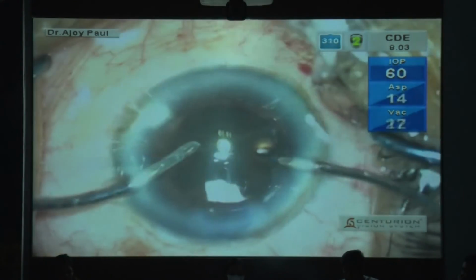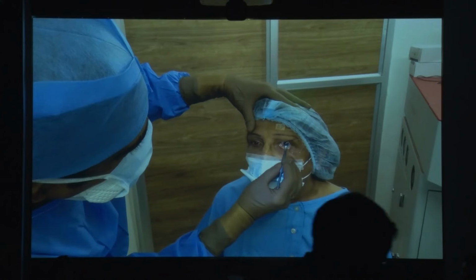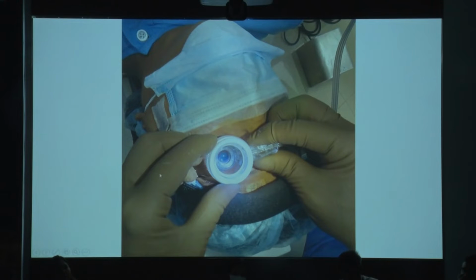If, let's say, above 1 diopter, definitely we would say go for toric lenses. Now this is when we are using the toric lens. This is what we are saying: marking outside at 0-180 degrees. This could be augmented with your smartphone. And when putting that IOL, you have the 0-180 degree marks there, and you just align it accordingly.